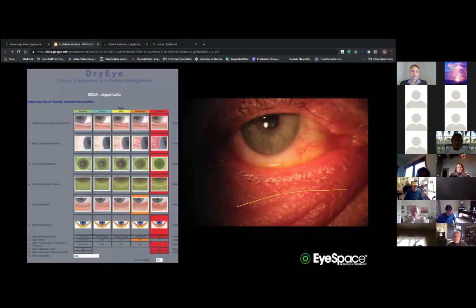Many soft lens patients who switch into orthokeratology do it because they have day wear dryness. When I hear that, the first thing I do is treat the dryness, and then I also do Ortho-K. So that's our approach.